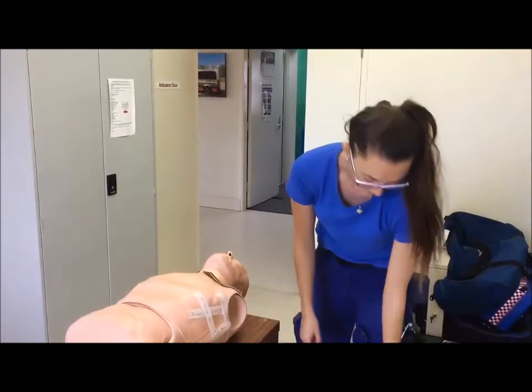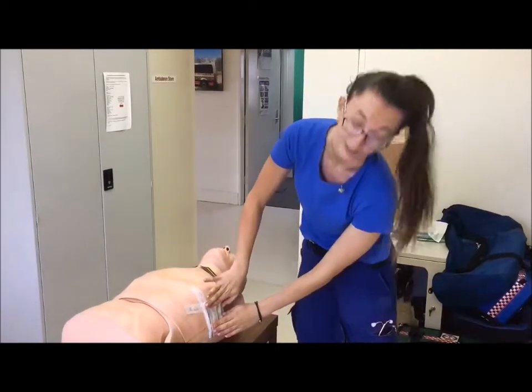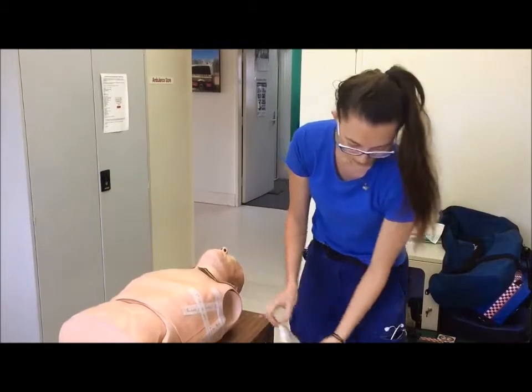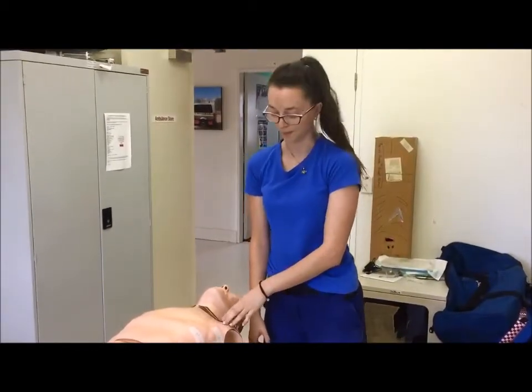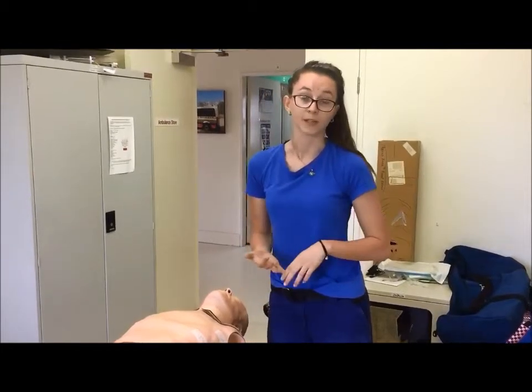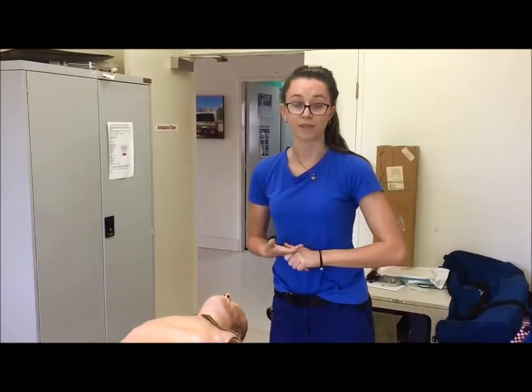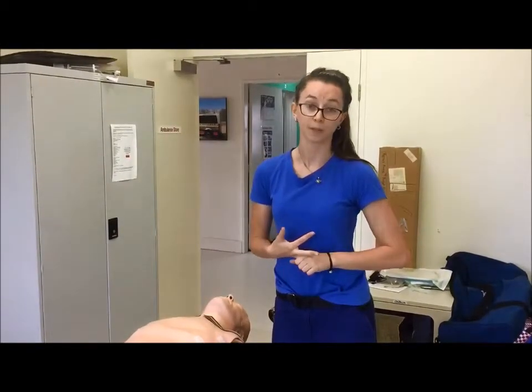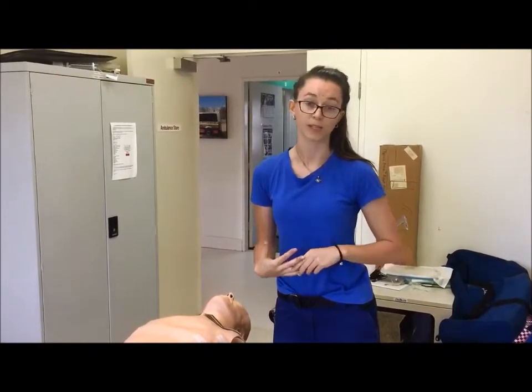After this, we would place an occlusive dressing, sealed on 3 sides to prevent redevelopment of the tension pneumothorax. After this, we monitor for signs that the tension pneumothorax has been released. There would be a decrease in tachypnea, dyspnea would improve, subcutaneous emphysema would lessen, the patient would increase cardiac output and blood pressure, and any other signs that indicated a tension pneumothorax would start to decrease.